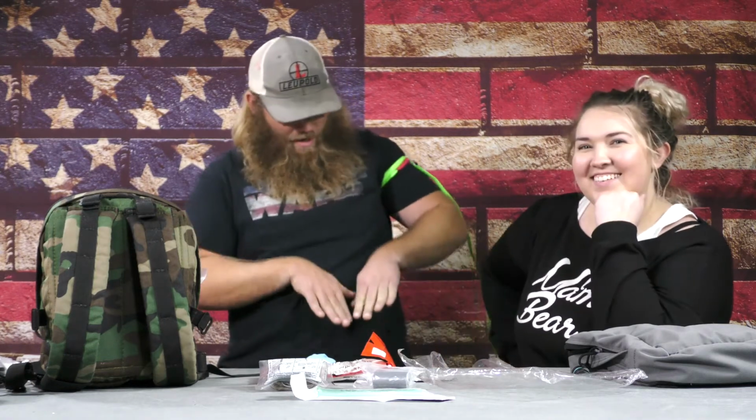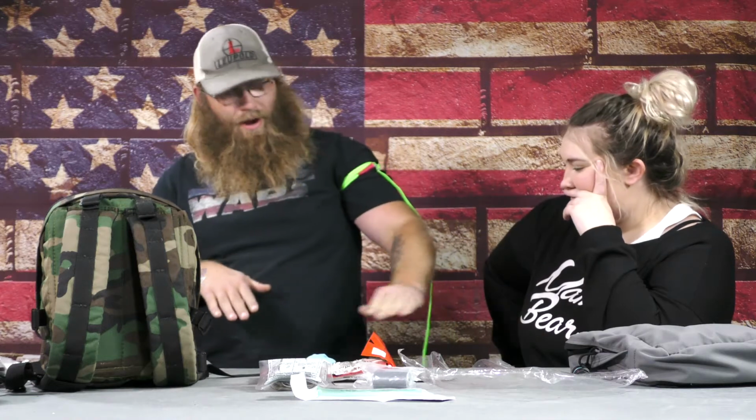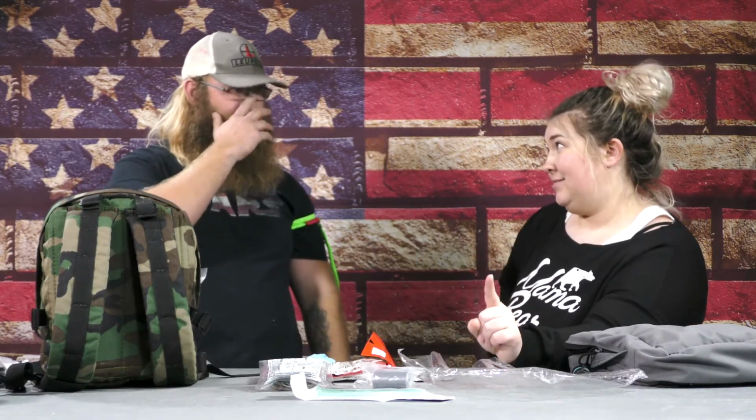For people who say it doesn't work, I don't know if you can see, but this hand is definitely white, and this one is not. I've heard people talk about how it damages tissue. I practice with this a lot, and I'm fine. There is always going to be 1 in a million where it messes someone up. But there are guys that were getting blown up in Afghanistan, having a tourniquet put on, being flown to Germany, and that was when the tourniquet was released.